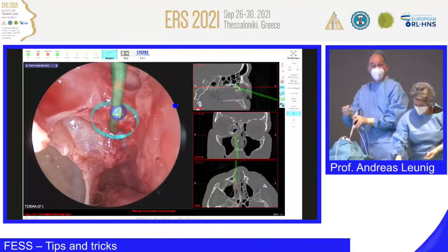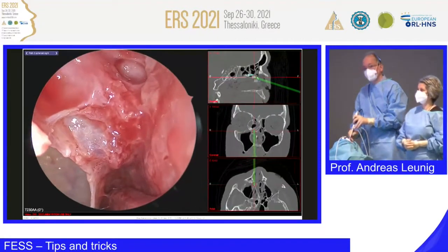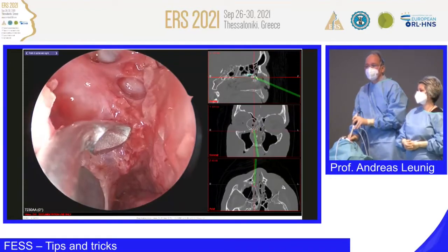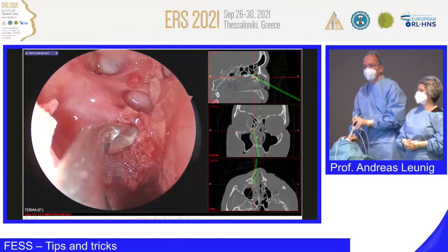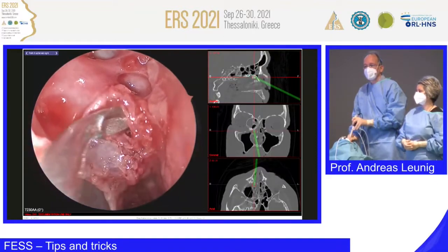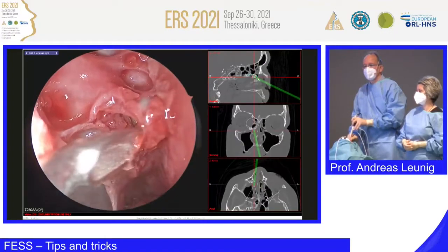It's the superior turbinate. It's very helpful, but sometimes it's resected, so it's not always there, it depends on the case. What I do in such a case, hopefully it's working, we will see, I try to go in and perforate the ground, the basal lamella, and make an opening.